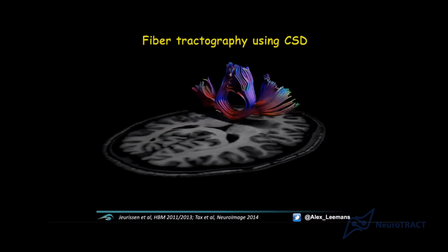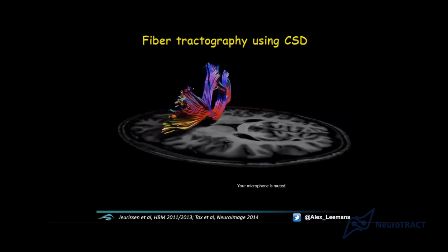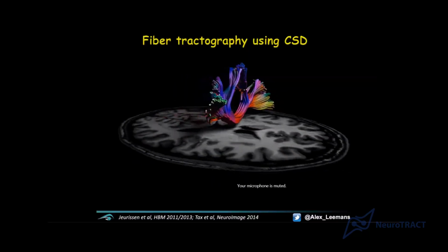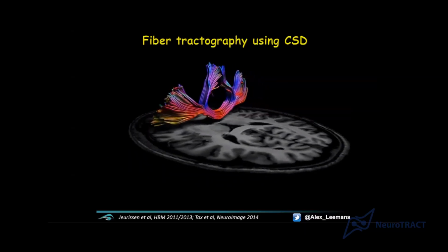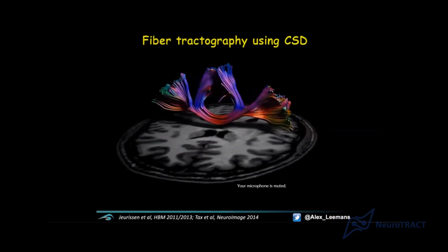But the point I want to make here is that with this other technique, you basically get a more complete picture of pathways. So the idea is, with this spherical deconvolution model, you would be more accurate in reconstructing pathways. That's the idea.